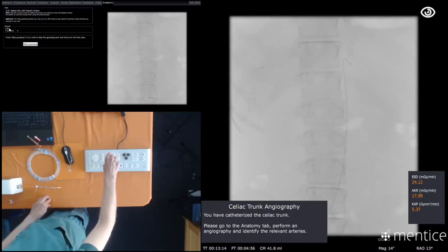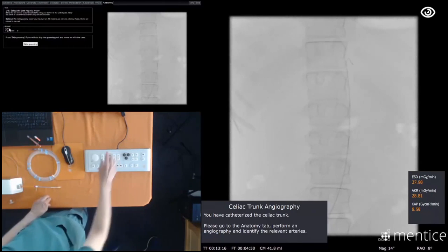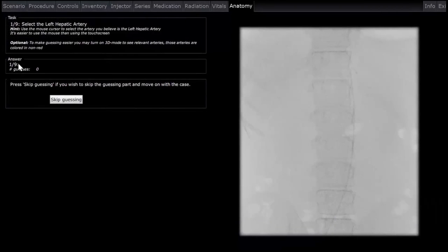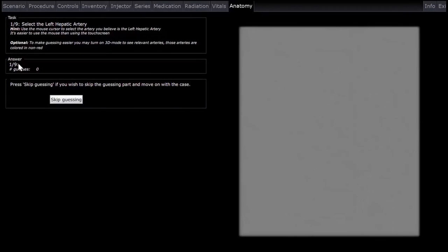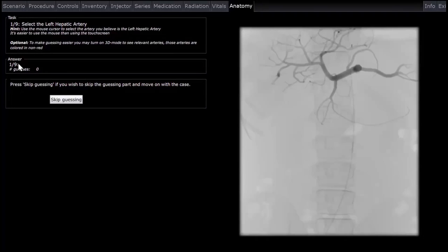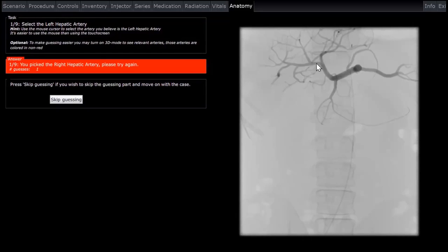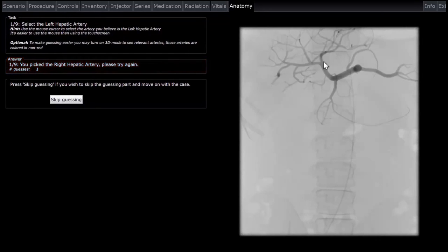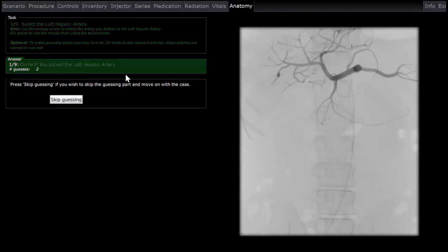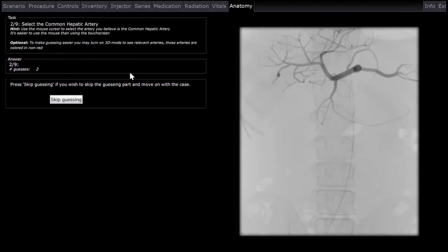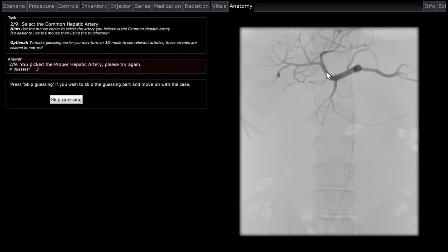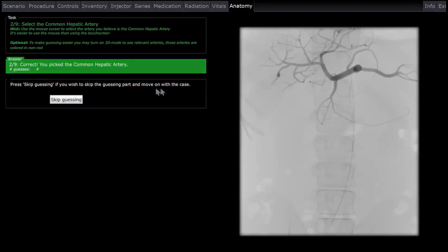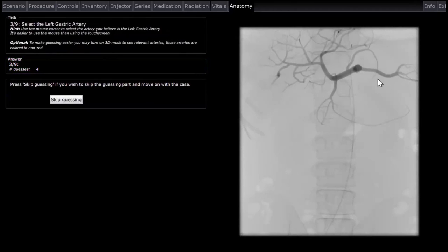This opens another feature of that module where the trainee is asked to identify the different arteries here. We can just do a couple of them. The first question here now is to identify the left hepatic artery. We need to do a DSA first to get some image on. And now we can select the left hepatic artery. Let me give it a try if I can find that. I'll just click somewhere. Let's see what the reaction is. That was wrong. That was the right one. So then it must be the other one. That was pure luck. But now it wasn't. You did the model, so you knew exactly where it was. The common hepatic, for example. So let's do one more. That was the proper. So where is the common? Further back? Yeah. Perfect. That's how you can go through all of the arteries that are concerning the liver and by that learn to identify them. We'll skip the rest here for the time's sake.